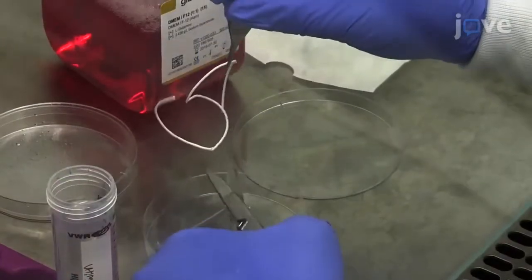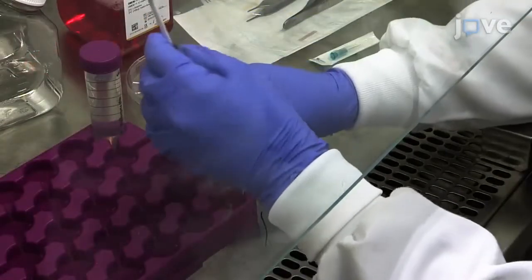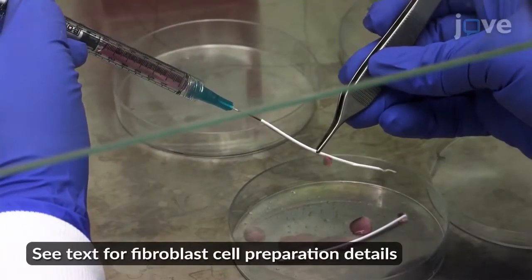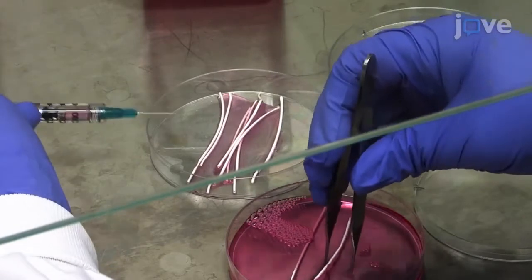At the end of the incubation, use sterile micro scissors to cut the fibers to 6 centimeters or less, and use a 1 milliliter syringe equipped with a 21 gauge needle to seed 1×10⁵ fibroblast cells directly into the lumina of the hollow fiber membranes.